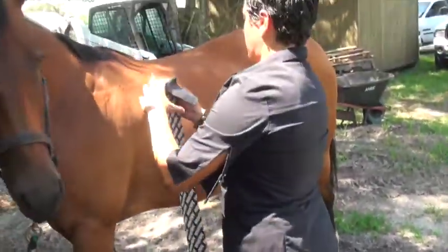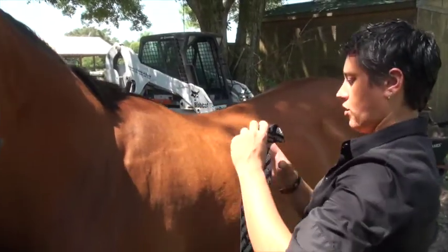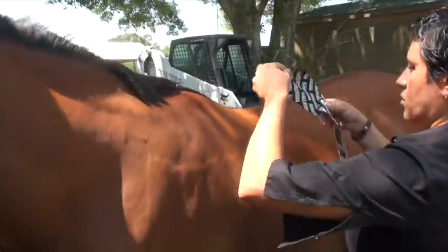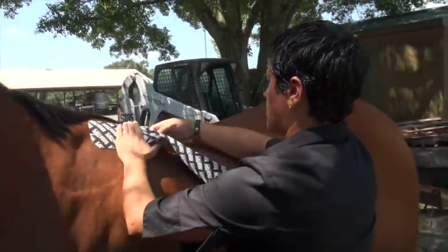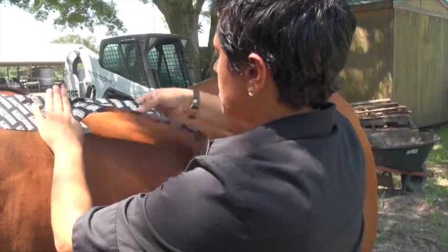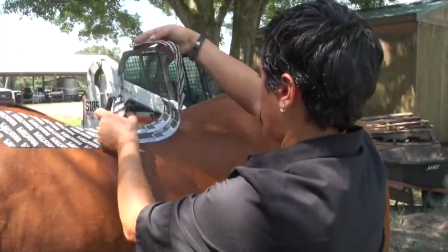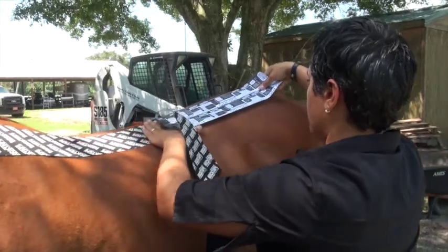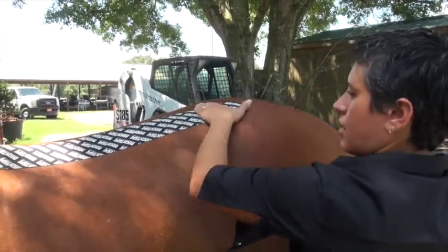And I'm going to place this pretty much right along the withers of the horse. Now we're going to be going along these paraspinal muscles on either side of the spine. So I'm going to place my base down, and then I'm just going to pull this paper off and lay the rest of the tape down along the back of the horse. We're just going to go all the way down the back.